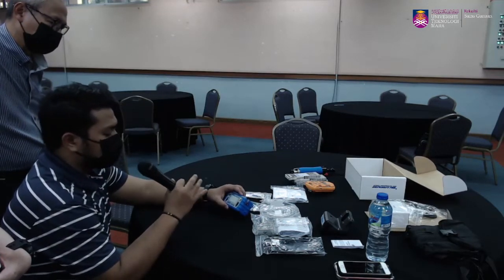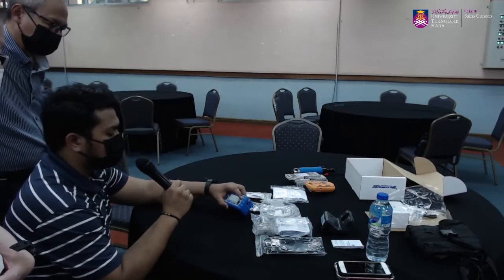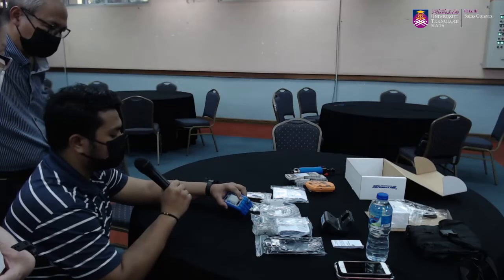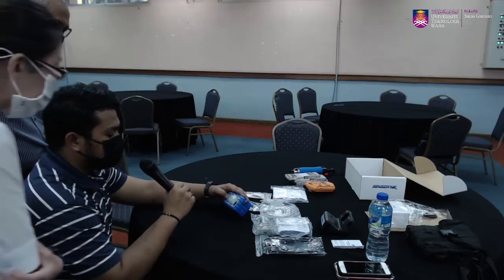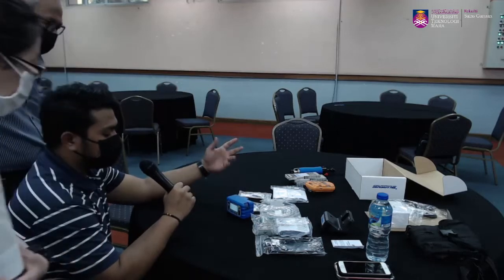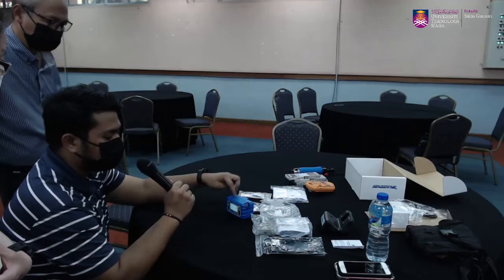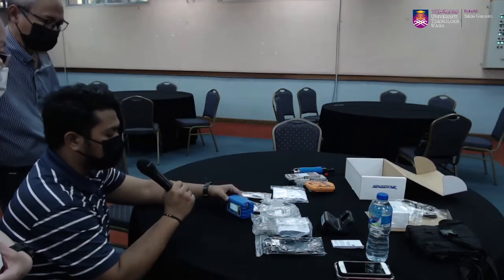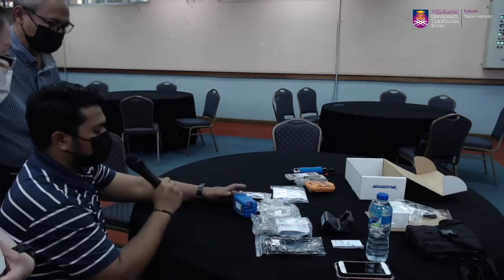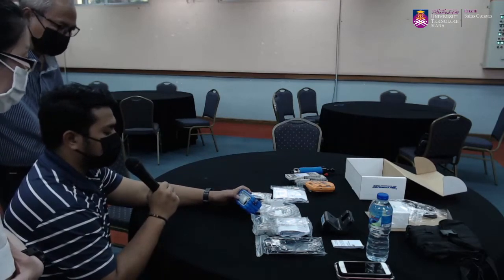Okay, so daripada situ kalau kita dah setkan kepada 1000 cc per minute, kita nak start the run, kita just press enter at the run punya ni lah. Okay, so apa dia bagi tahu in terms of battery not full means that kita kena alarm lah, aware in terms of runtime kita tu, dia tak lama lah as per berapa flow yang kita dah set. So make sure before kita gunakan peralatan ni, kita fully charge dulu lah. Okay, so dia akan slowly increase sampai 1000 cc per minute which yang I dah set tadi.